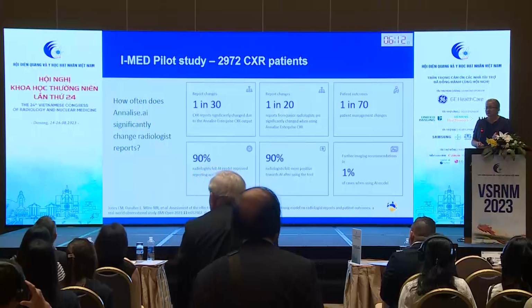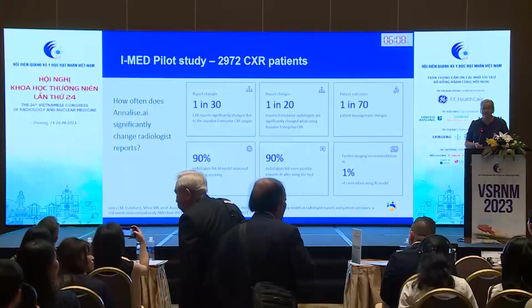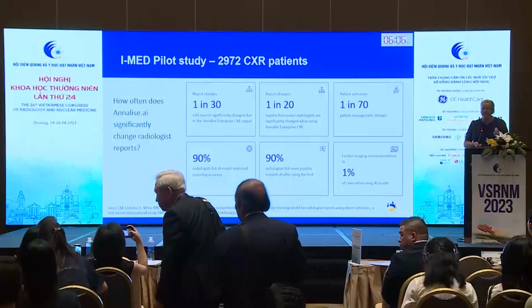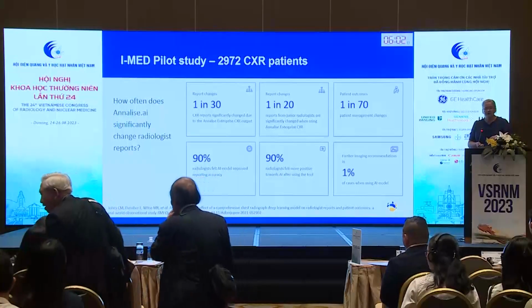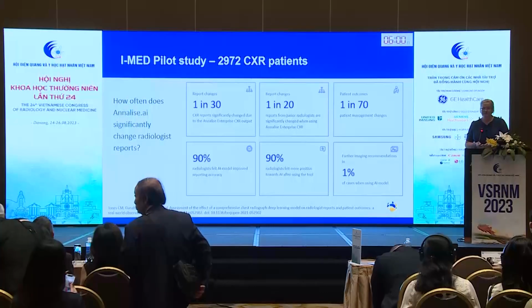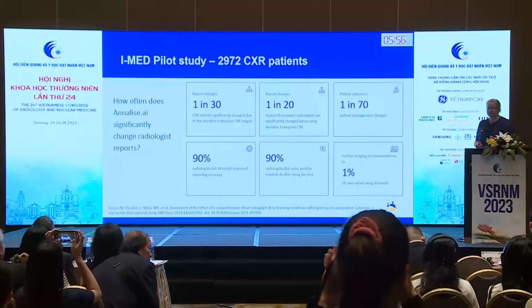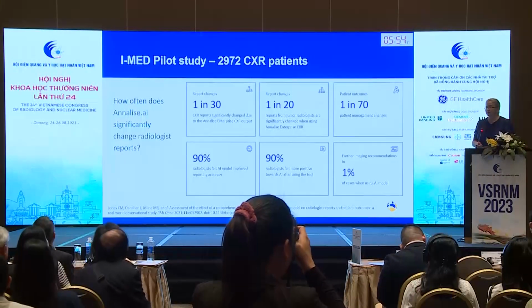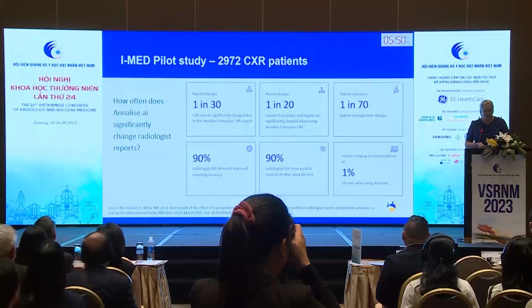Then we did some testing on our own patients with our own doctors. We had 11 consultant radiologists test this in real practice for 6 weeks. And we had nearly 3,000 patients, every chest X-ray patient that these 11 radiologists reported for 6 weeks.